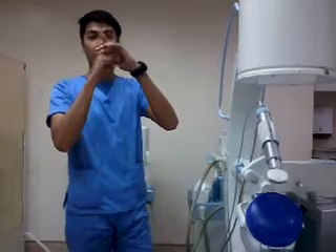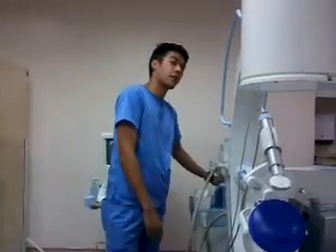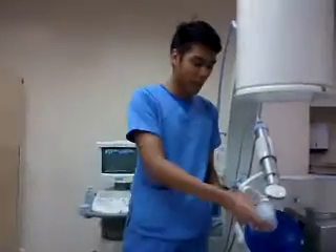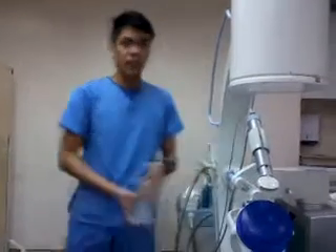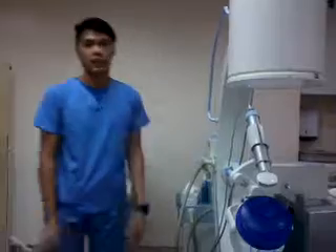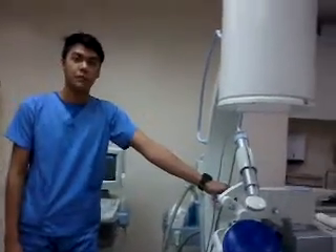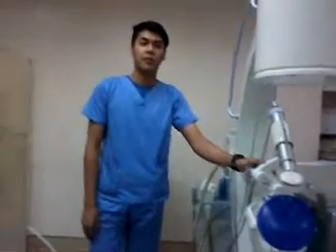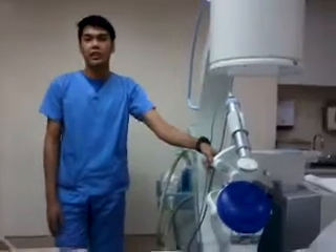I'll demonstrate this on a volunteer — I'll place the probe on their finger to simulate the procedure. This is for your benefit: even in your first year, I do this so that if you are ever assigned to an ESWL, prostate, or similar unit in other hospitals, at least you'll have a gist of it and can explain it on your own.